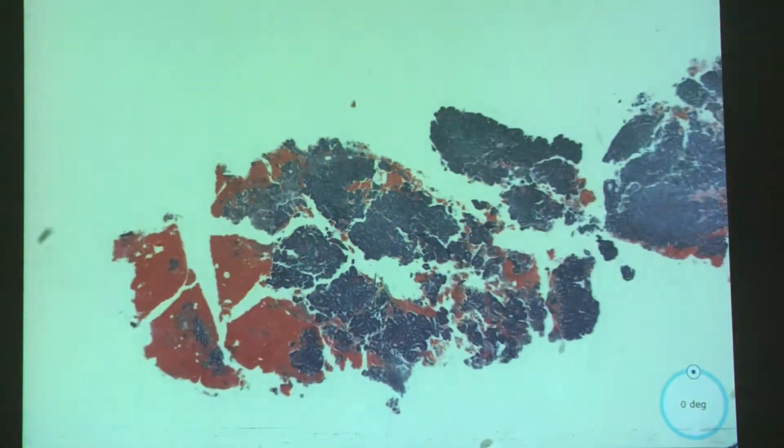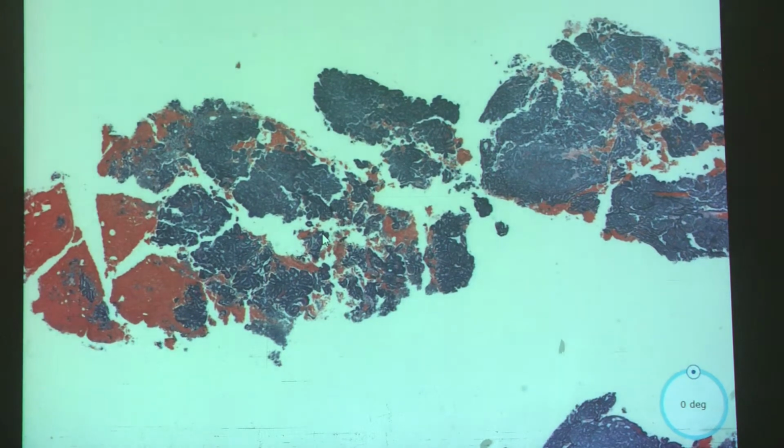So this would say something like: papillary DCIS with papillary architecture. See note. And in the note, you could estimate the size. ERPR will be reported in addendum. Given the limited specimen, this measures up to this, and associated invasive carcinoma cannot be entirely excluded. Yeah, something like that. The wording is the most difficult part, right?